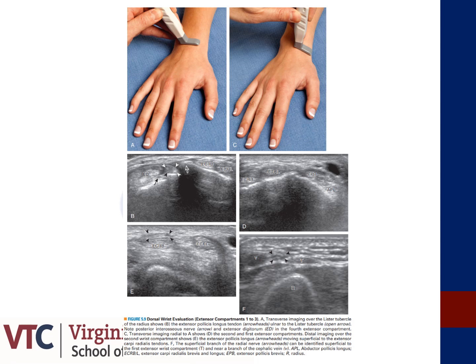Figure E demonstrates your third extensor compartment as your EPL tendon traverses superficially to your second extensor compartment. And figure F demonstrates the superficial branch of your radial nerve as it is superficial to your first extensor compartment.